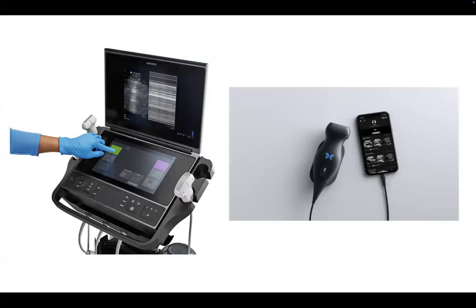You guys have all seen this. The one on the left is actually our machine in the ICU now. The one on the right is a Butterfly, which is a handheld device that a lot of the adult docs are using, and have their own devices, and that plugs right into a phone. And transport has a similar device that plugs into an iPad. So it's becoming smaller and smaller. And I think the technology on the right is really where things are headed in terms of the portability of it all. And there are some med schools that are giving out these devices to first year med students. I'm not totally keen on that, but that's a separate story.